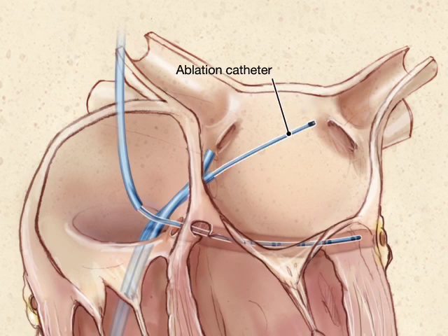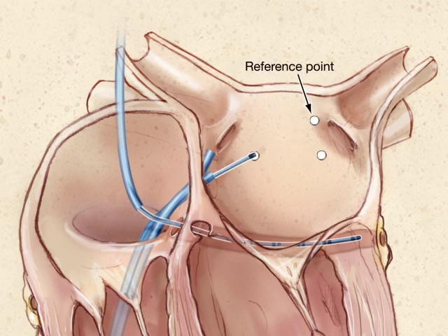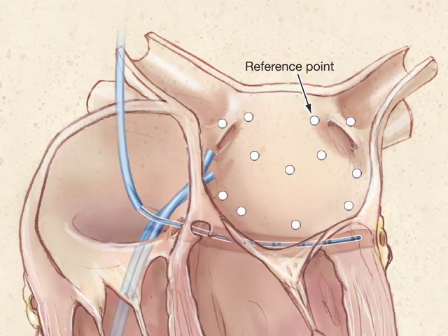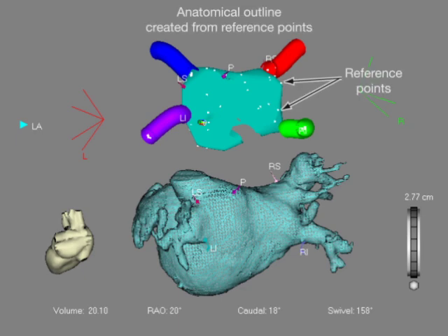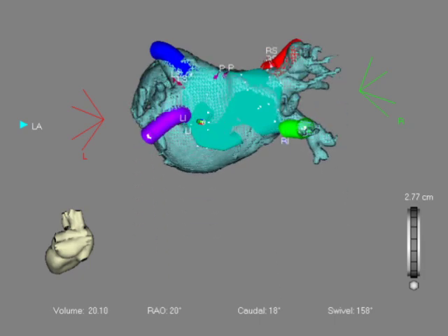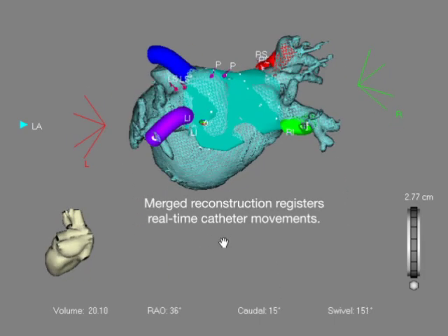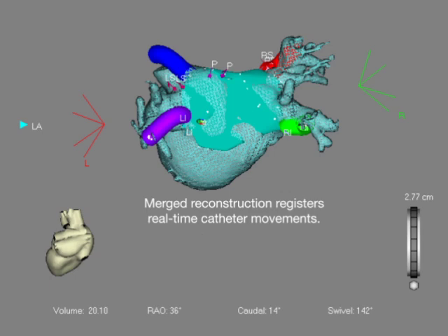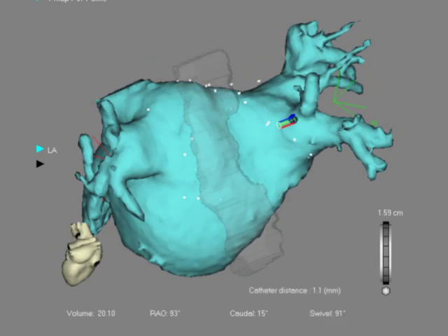An ablation catheter is introduced and used to tag a series of anatomical reference points on the posterior left atrium and the pulmonary veins proper. These points together create a basic anatomical outline that is then used to register the true anatomical position of the catheter within the three-dimensional reconstruction generated from the patient's CT data. An assistant at the computer workstation integrates this basic outline with the three-dimensional reconstruction, subsequently allowing the operator to navigate inside a virtual shell of the patient's left atrium.